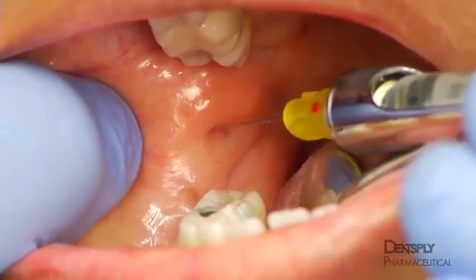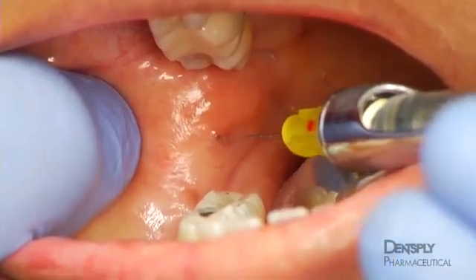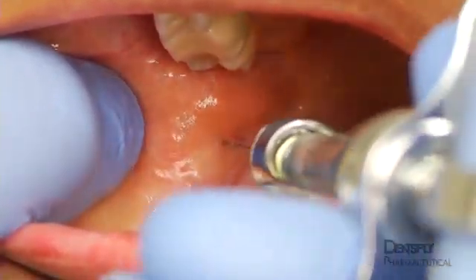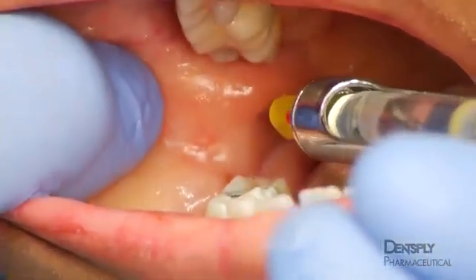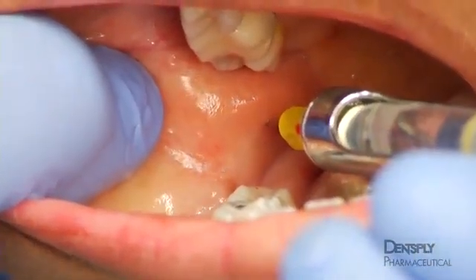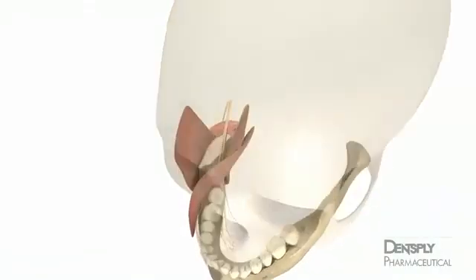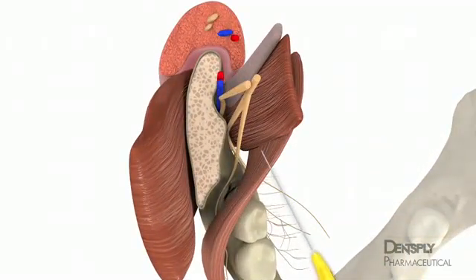Regardless of cause, the needle tip strikes bone too anteriorly on the ramus and must be repositioned. The needle is partially withdrawn, the barrel is brought medially, and the needle is reinserted along the new path. Once past the obstruction, the syringe can be repositioned to its original orientation. In the patient where no bone is originally contacted after an insertion of 2.5 centimeters, there is the possibility that the needle tip is medial to the mandibular sulcus.